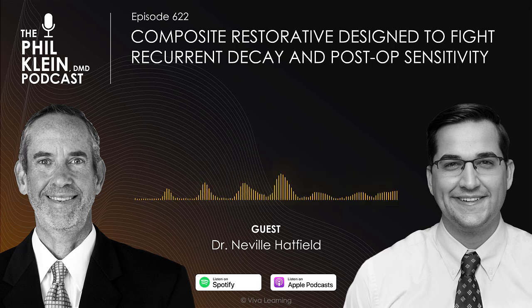So failures don't often come from recurrent decay. They might come from physical injury, right? You have a class 4, you bite into something, it pops off, right? That's where I think a lot of the failure comes with restorations when using something like Shofu's products. It's less so from recurrent decay, which is, again, a very common issue.